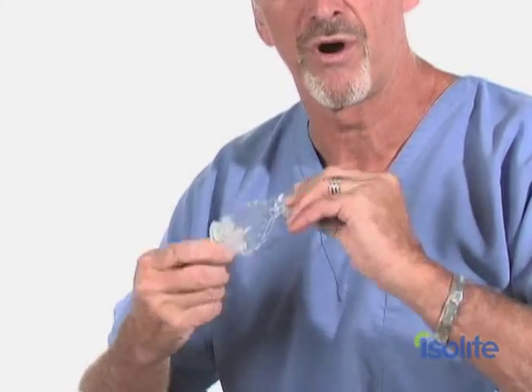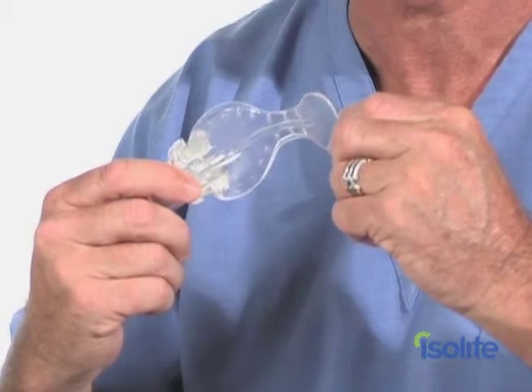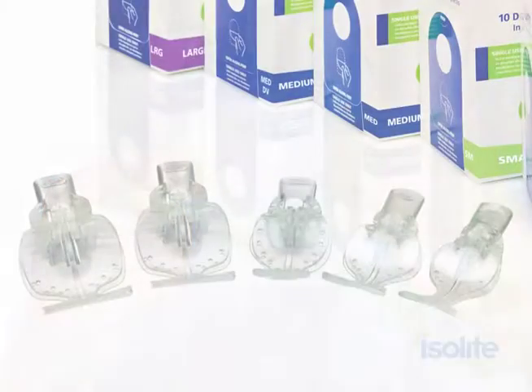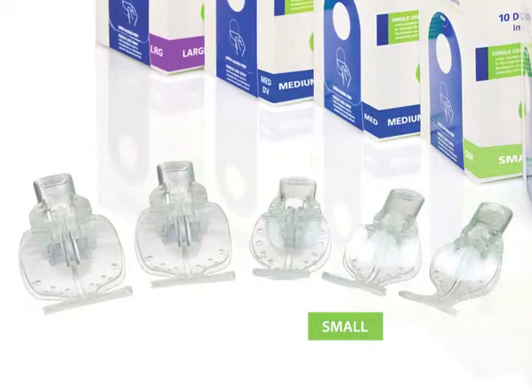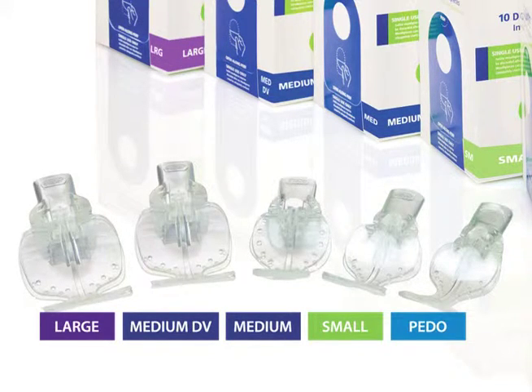The mouthpieces themselves are made of a soft, flexible, hypoallergenic material we call Isoflex. It's silicone free, it's latex free, and it's available in five different sizes: small, medium, the medium DV, large, and a pediatric size.